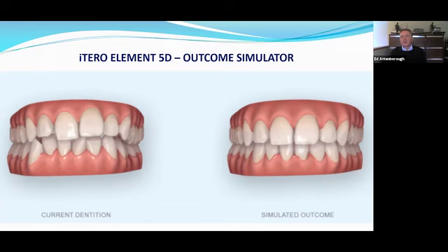So we're going to see the automatic design propositions, the automatic analysis of preps and bite, and the outcome simulation as a big growth area in the software. But again, that shouldn't be something that makes you pause and think, should I dive in now or should I wait? Because again, the hardware is there, it's the software that's moving very quickly now, and some really powerful tools to help your practice and your clinical workflows.